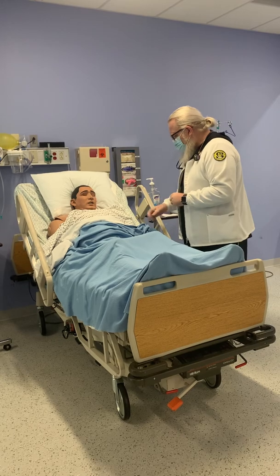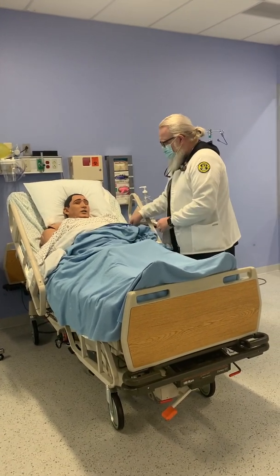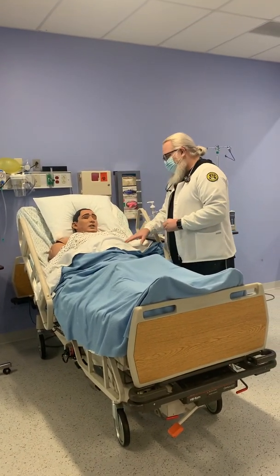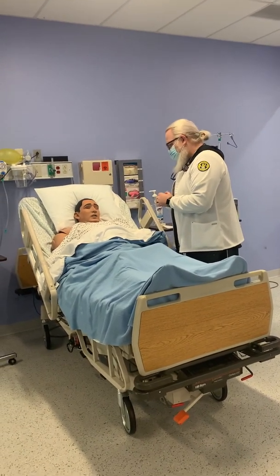Great. And do you have any allergies? No? Good. Checking to confirm. Okay, what I'm going to do is I'm going to get prepared for the procedure. Do you have any questions before we begin? When was the last time you had something to eat or drink?